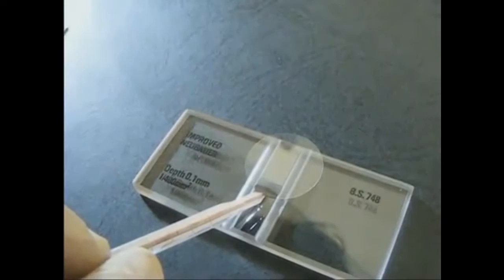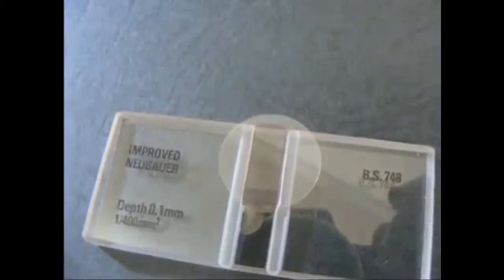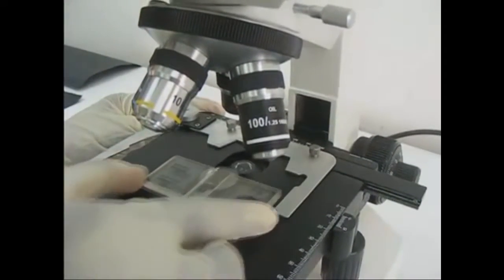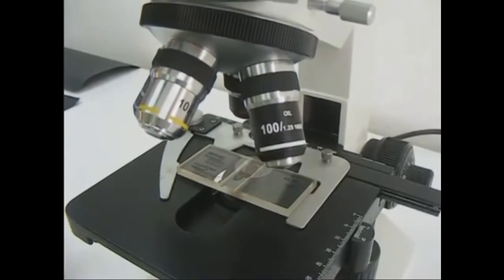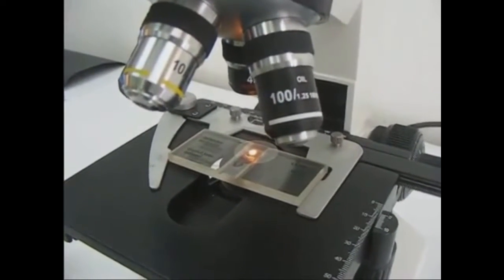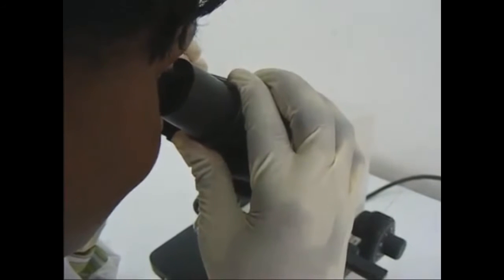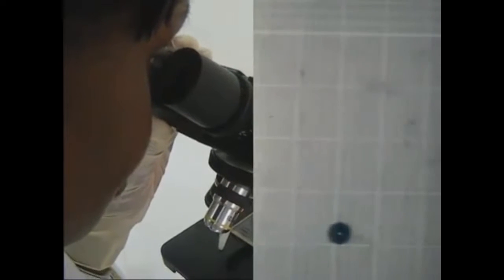The counting chamber is then filled with the diluted blood. The hemocytometer is mounted on the stage of the microscope, and various adjustments are made for suitable viewing. At the objective magnification of 4, the counting chamber is brought into focus.